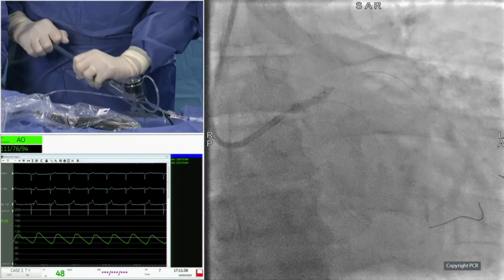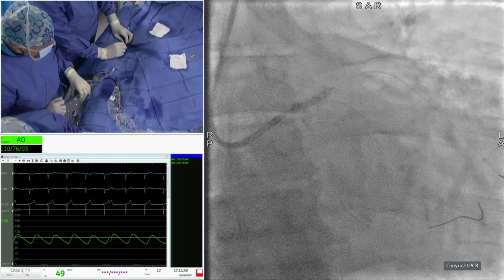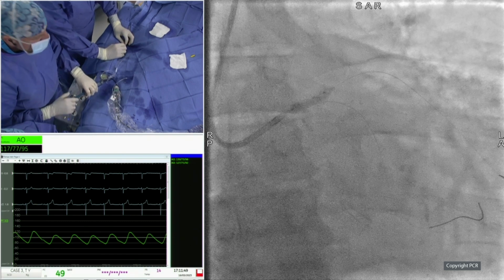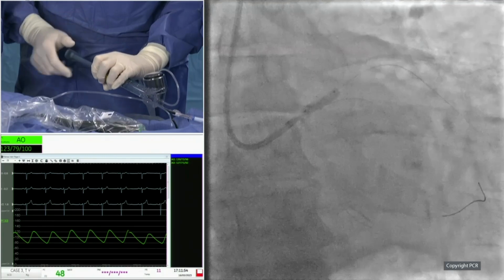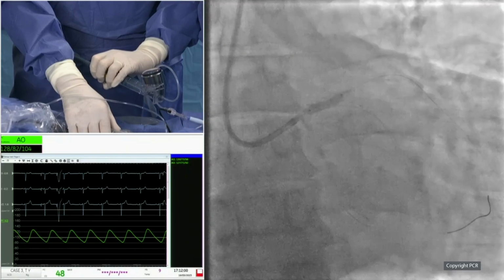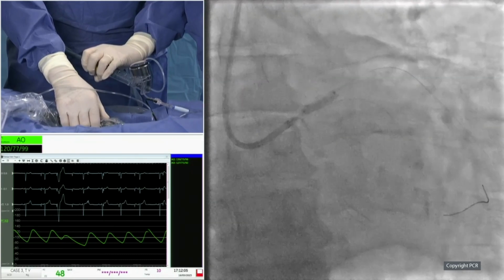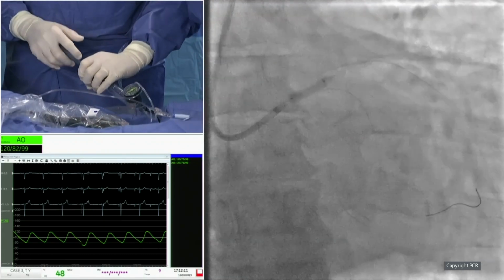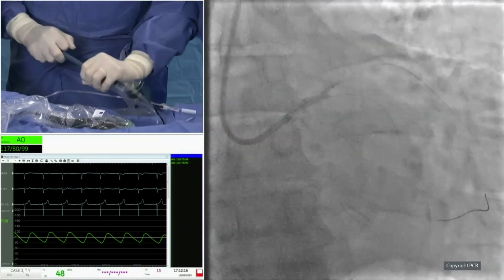We use a Shockwave C2 Plus, 4 millimeter in diameter by 12 millimeter in length. We decided with Bruno to use 12 cycles of 10 pulses for the patient and to perform a little overlap of 2 millimeter for the balloon. It means that we will probably perform 6 cycles at this place, then pull back a little and perform 6 cycles more proximal to the left main.